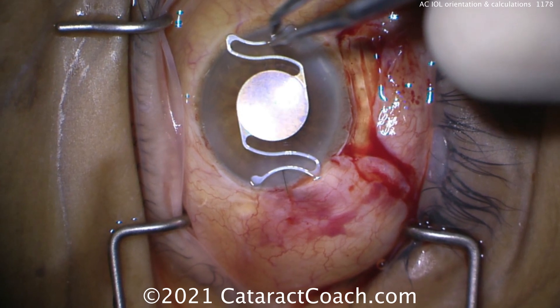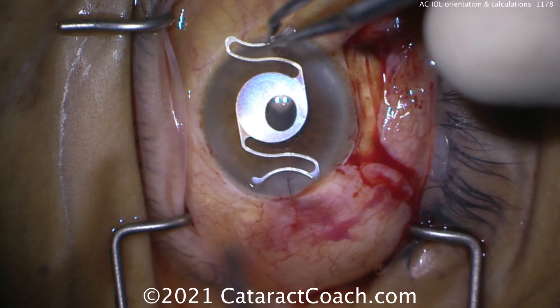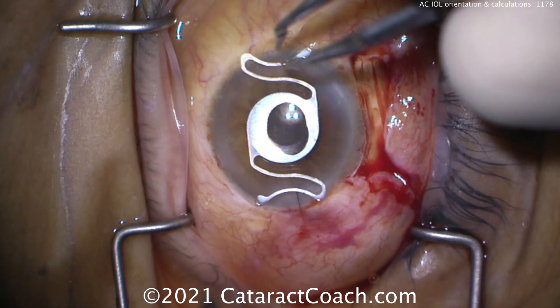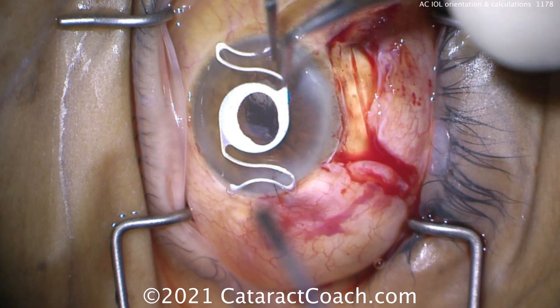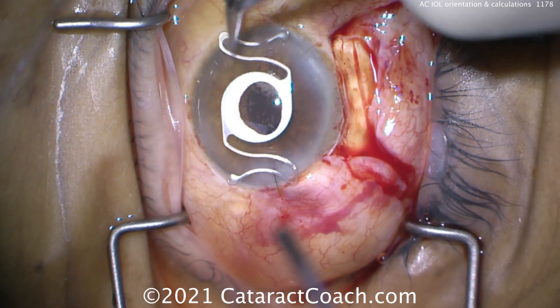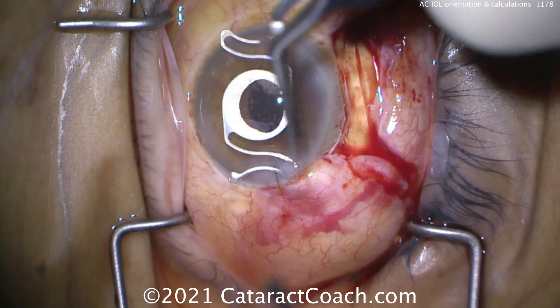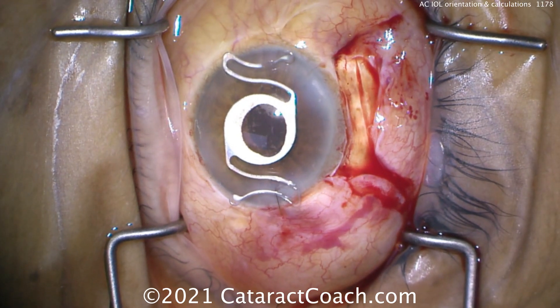That haptic-optic junction is going to have the same anti-S orientation as a standard posterior chamber lens. Don't look at the foot plates that are going to go on the angle of the eye — look right at the haptic-optic junction. I'm showing you the lens here on top of the cornea. This is the correct orientation — memorize this. Where the haptic touches the optic, right there at the haptic-optic junction, that's the same anti-S as opposed to a posterior chamber lens. It should not be the letter S at that haptic-optic junction.